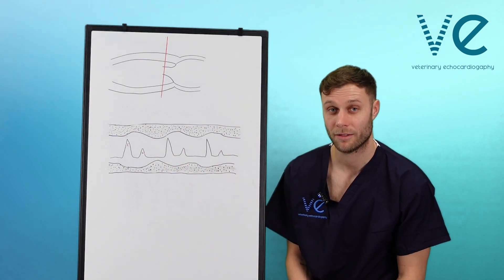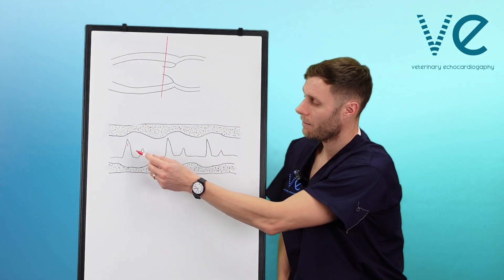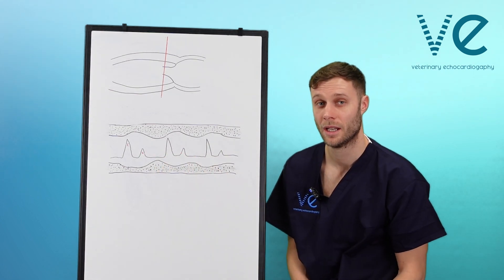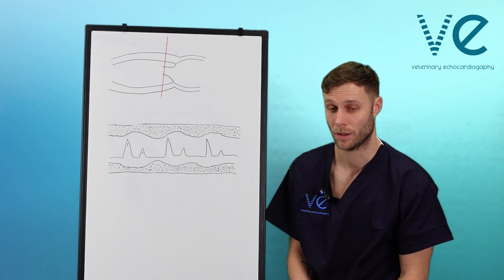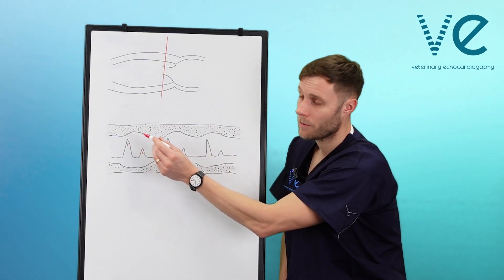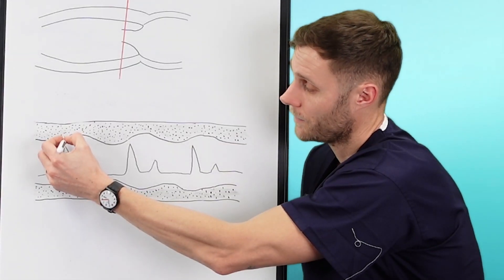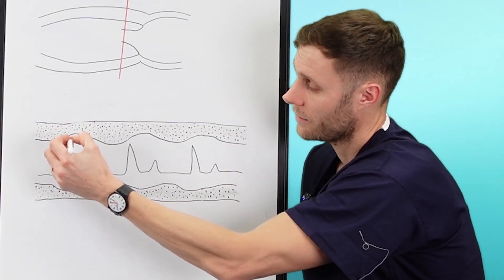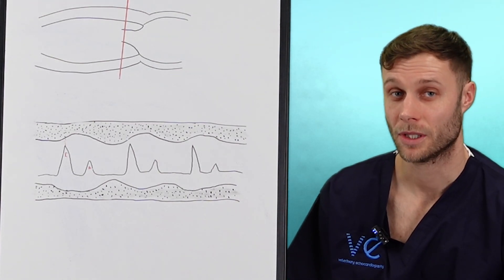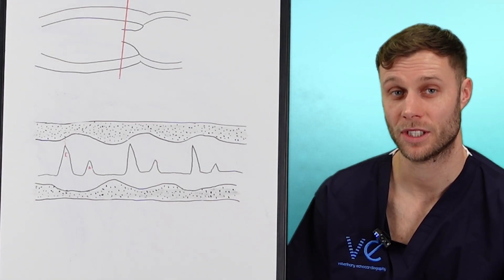The A-wave represents atrial contraction. After passive filling, the atria contracts and once again we get a little deflection of the mitral valve towards the septal wall. The measurement we're interested in is the distance between the top of the E-wave and the septal wall — we measure from the E-wave to the start of the septal wall — and that measurement has a strong negative correlation with ejection fraction.